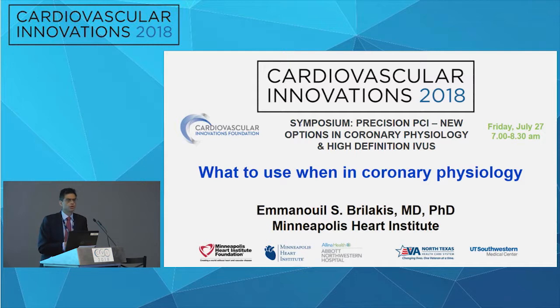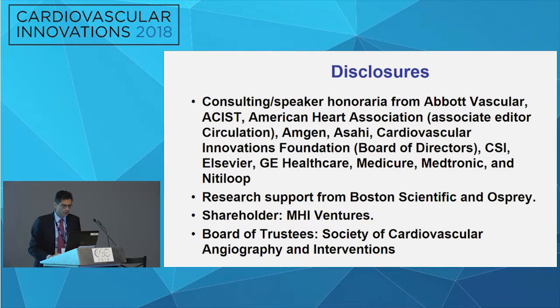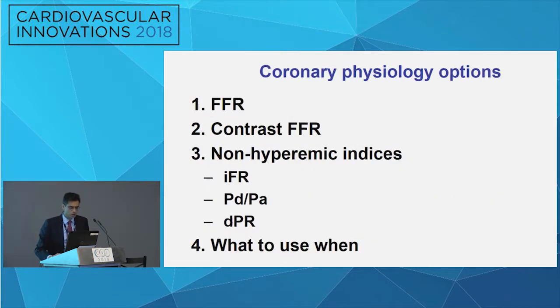How many people don't use physiology, just use intravascular imaging for determining severity of stenosis? Okay, so the minority, good. Well, you shouldn't, I'm kidding. But as you know, for assessing severity of lesion, except for left main, where obviously imaging is good, the IVUS in that area, but for the other, for determining severity of lesion, physiology is the way to go. So you've heard there are many, many different tests. These are my disclosures. And we'll just do a brief overview and discuss once again which one to do when.